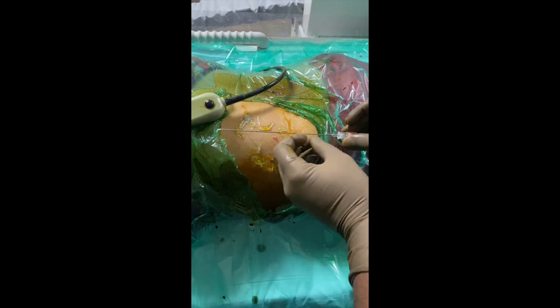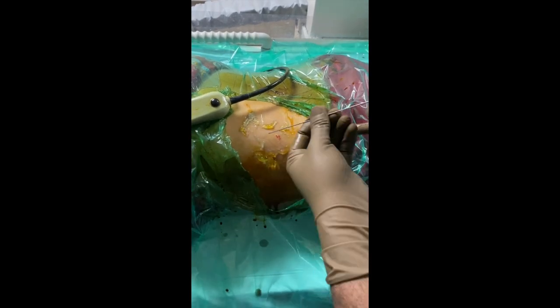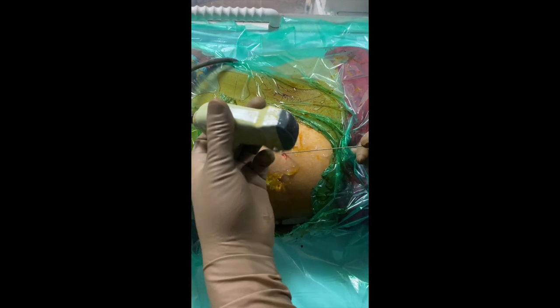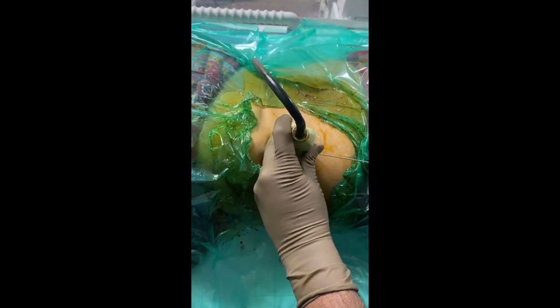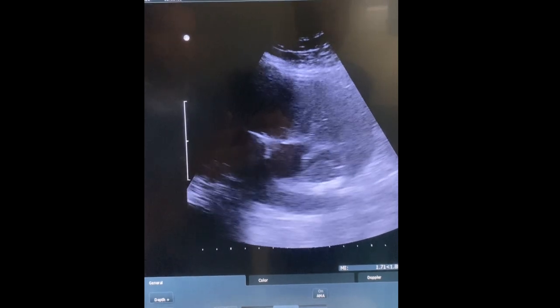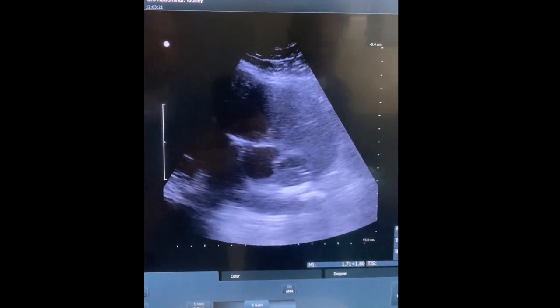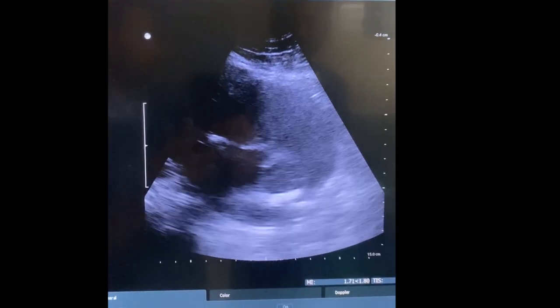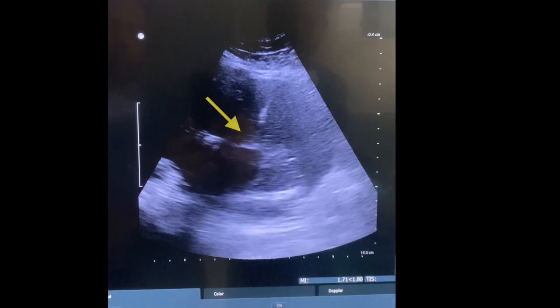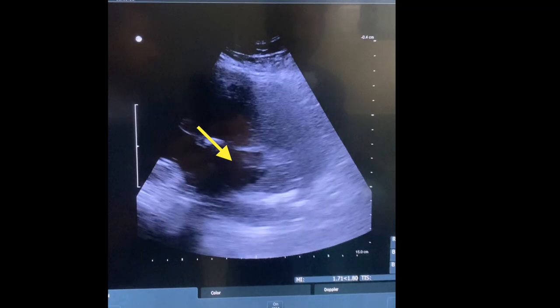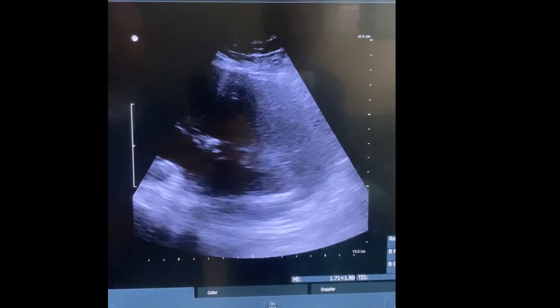The length of the needle is assessed, and holding it with the right hand using the thumb, the needle is introduced into the skin. The ultrasound probe is then aligned in that direction to track the needle entry. On the ultrasound image, as indicated by the arrow, the needle is slowly entering into the system and is now in the perinephric space within the hematoma. It is then advanced slowly further toward the desired calyx.